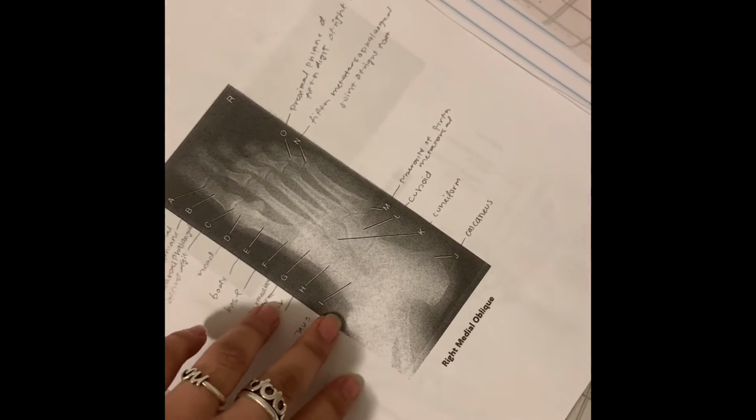And I'm going to be showing what I have on this picture on the right medial oblique on his foot. So if you could please place your foot flat on the bed for me. Yes, ma'am.